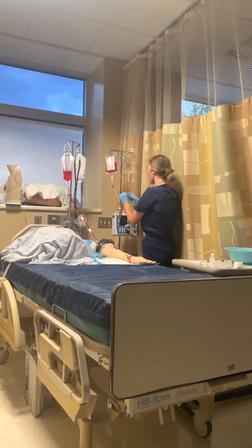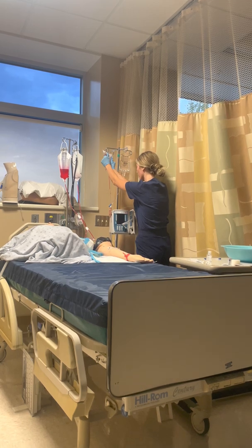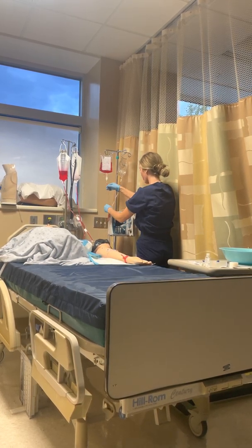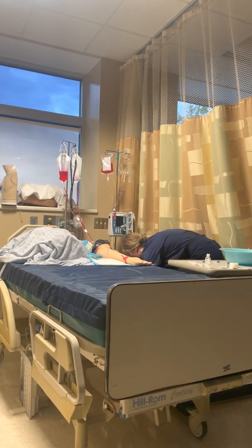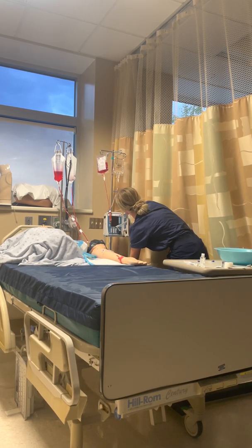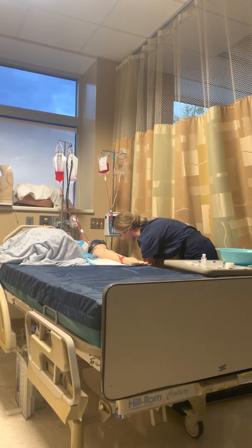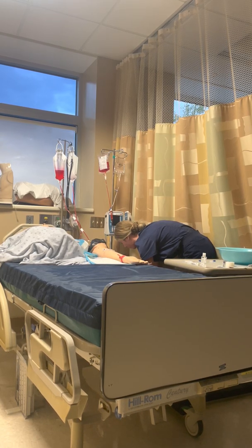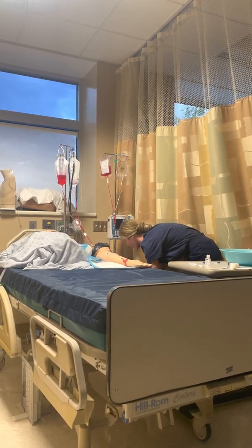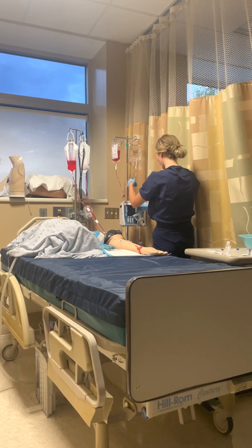So again, I'll make sure that the normal saline is locked. And then I'll open up the blood here and we'll prime this through. So I'm going to give it a good couple squeezes, and we'll prime that all the way down to the bottom of the line. All right, good. Perfect. So now that is all primed, and I'll make sure that this is unlocked, and then we'll get it set up to the IV here.